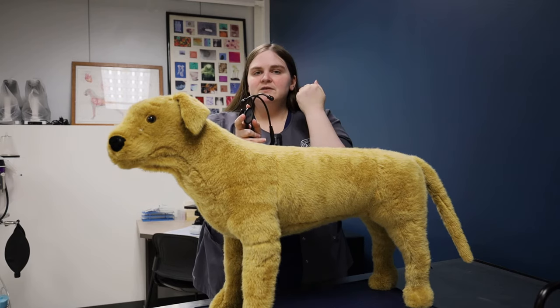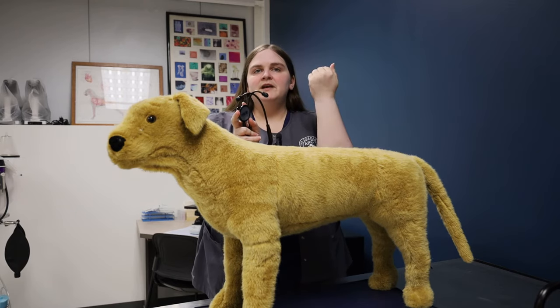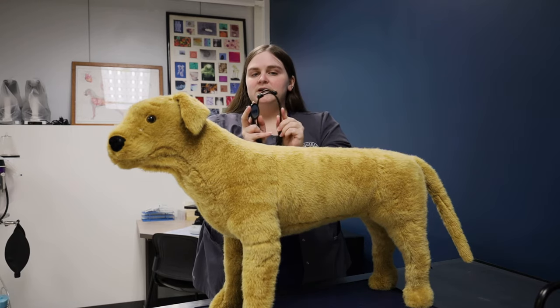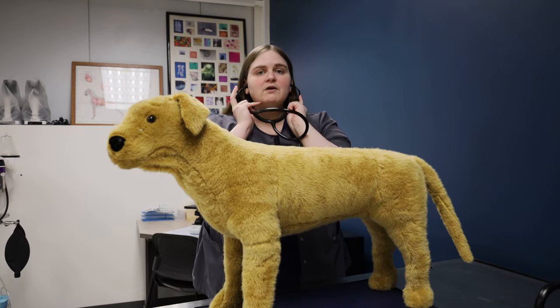If they slant backwards into our ear canal, then they're going to hit the back of our ear canal and we're not going to hear anything. But if they slant forward into our ear canal, we will hear things. So of course, we always make sure of that.